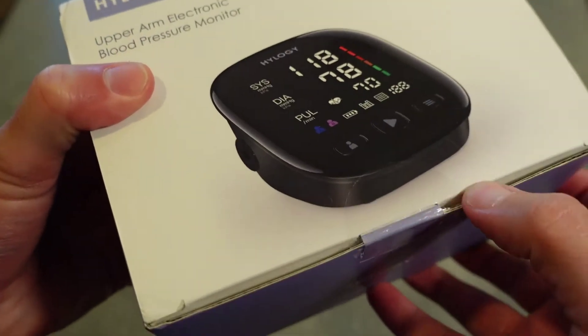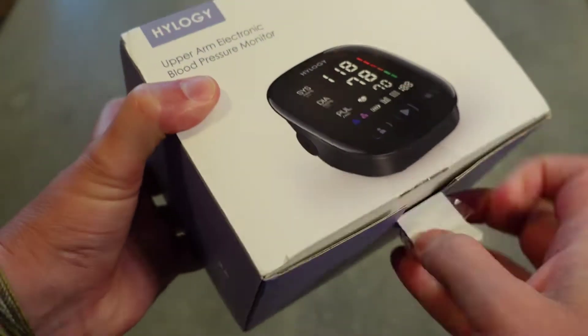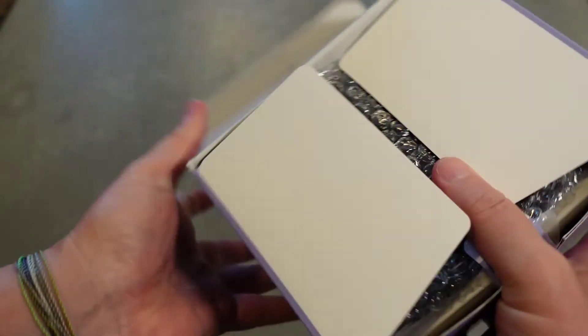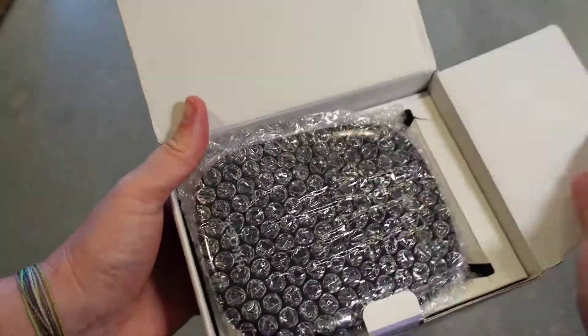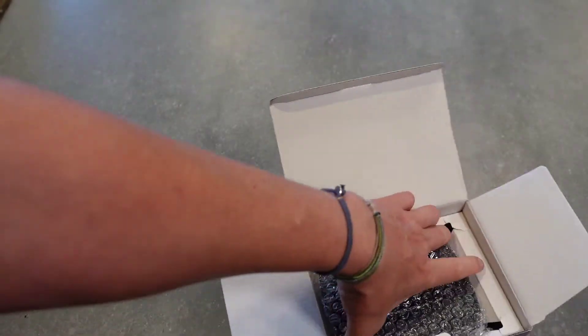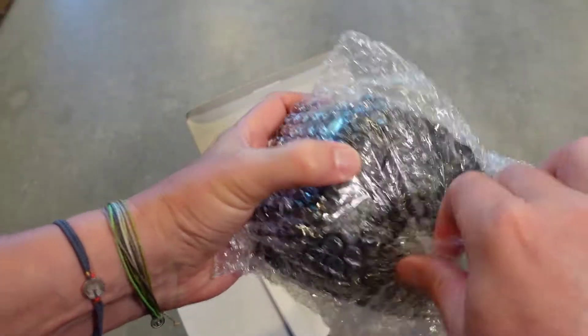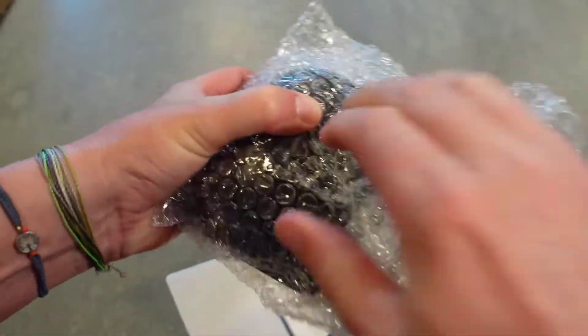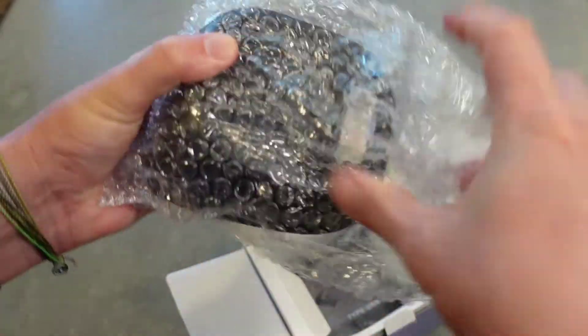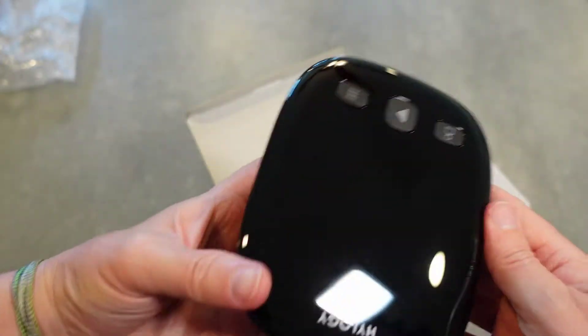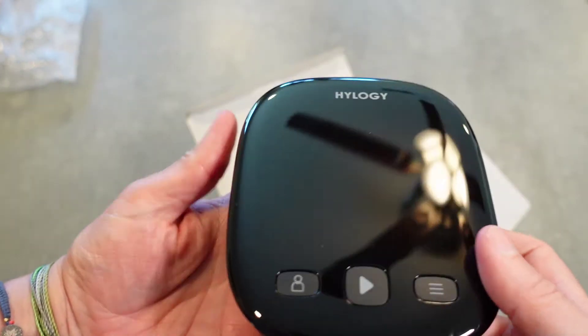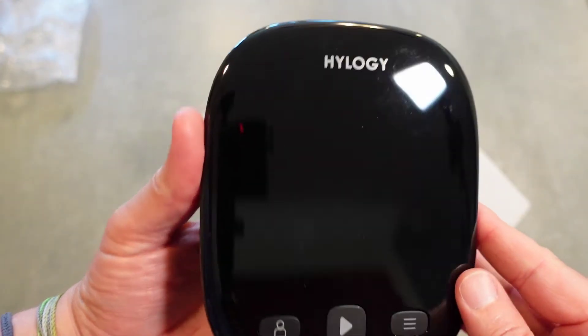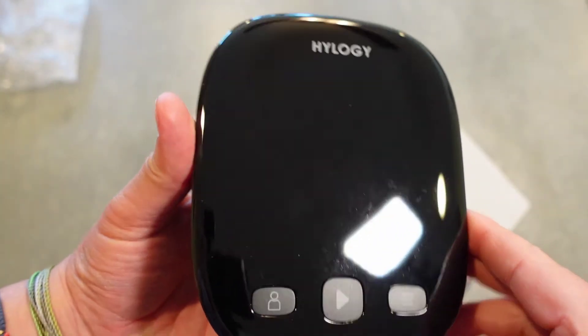Let's open it up and see what's in the box here. All right, so this is the unit itself. This is the main unit there. Nice slick black finish with the name Hylogy.